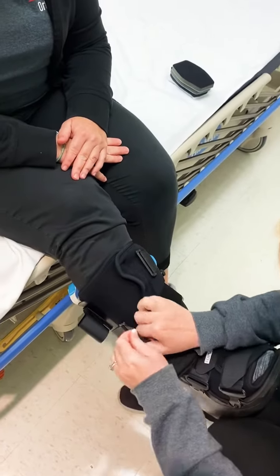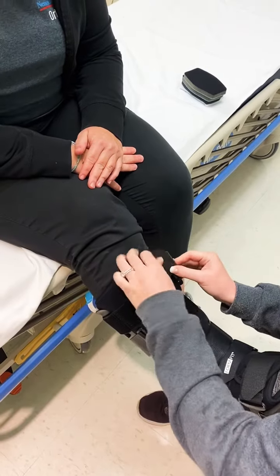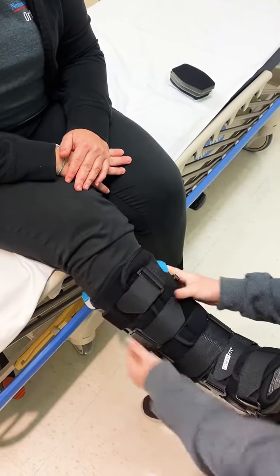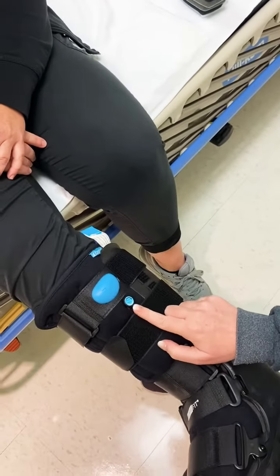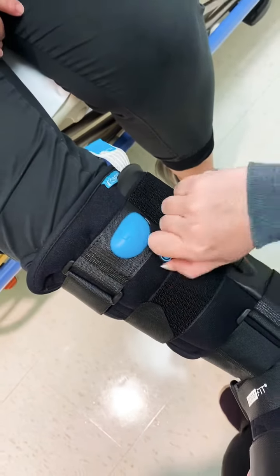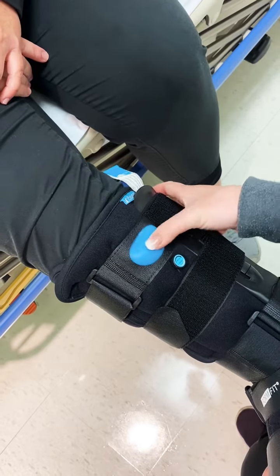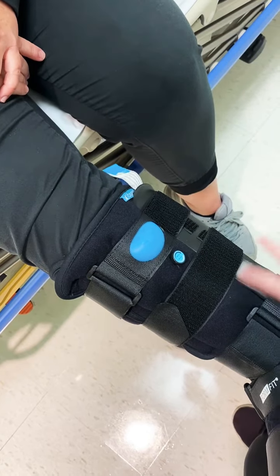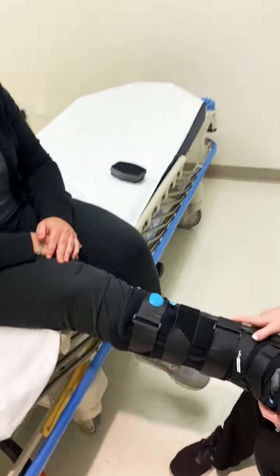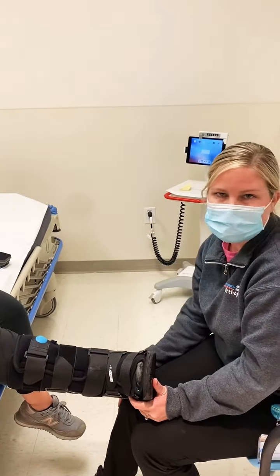Once it's all the way strapped, you can show them the air pump. The air pump is right here — it has an inflate and deflate option, which makes it easy to use. Turn it all the way to the right and start pumping it up. Let the patient know it'll fill with air around their ankle, which gives a little more support and can be more comfortable. Sometimes providers will want you to add air; sometimes they'll say it's optional for the patient.